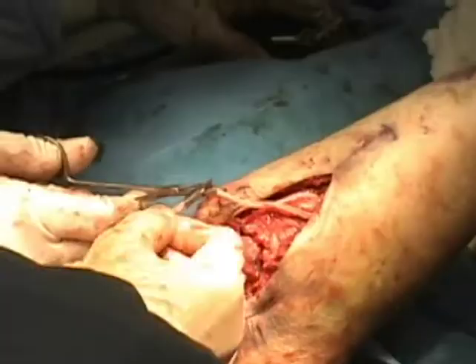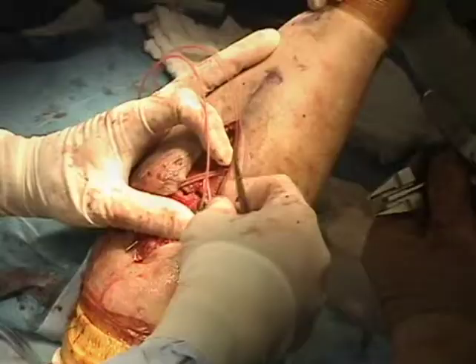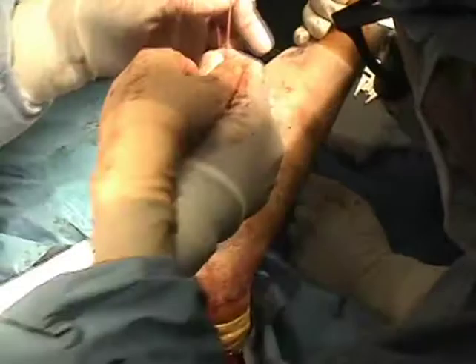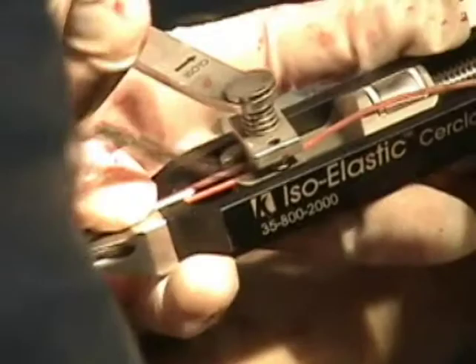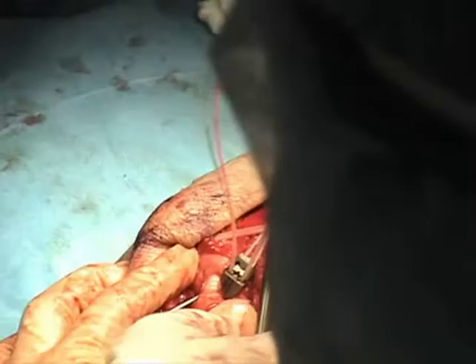The clip which tightens the cable is placed on the posterolateral aspect, which gives adequate soft tissue coverage. The torque tightening device is applied, and the torque used to tighten it is to the low torque line on the device itself. This is done slowly and gradually and it equalizes the tension throughout the figure of eight.